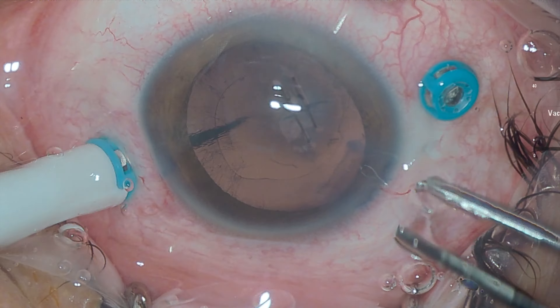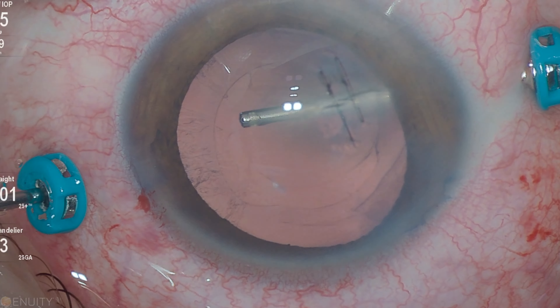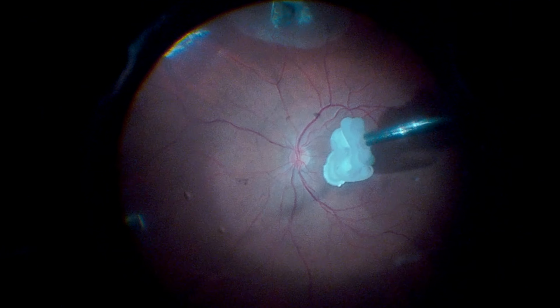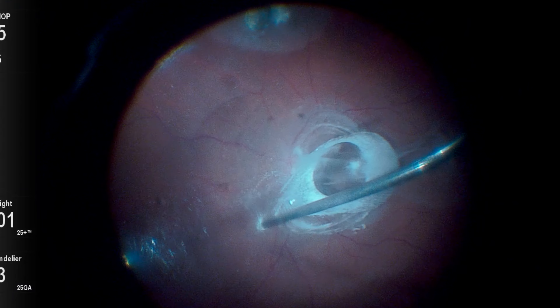Trocars are positioned and a posterior capsulotomy is performed with the vitrector. Upon entering the eye, we can observe that the intraocular foreign body is fortunately positioned in the lower part of the retina. Triamcinolone is used and posterior vitreous detachment is then performed.